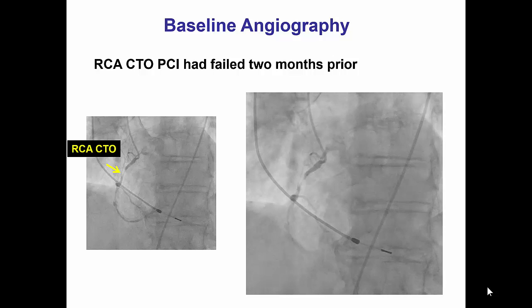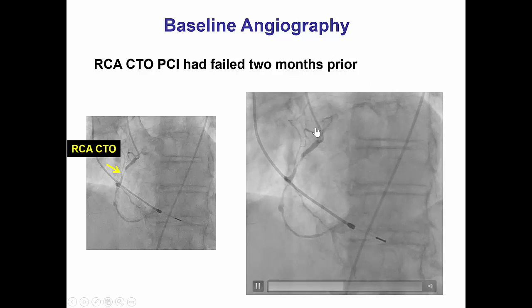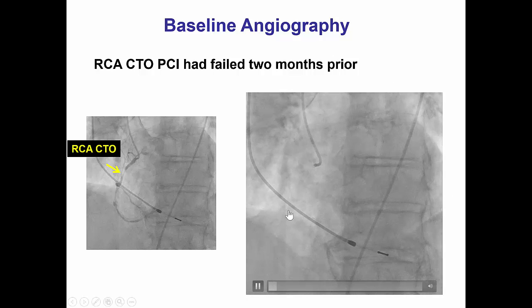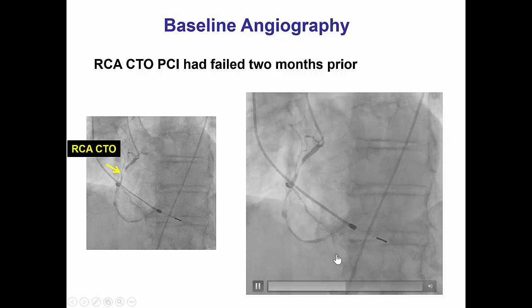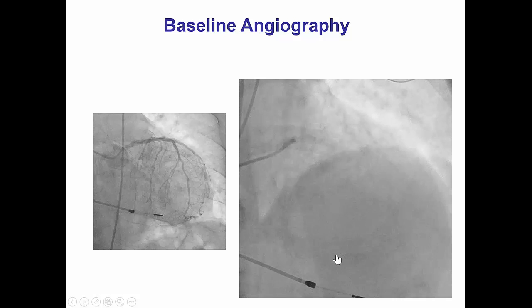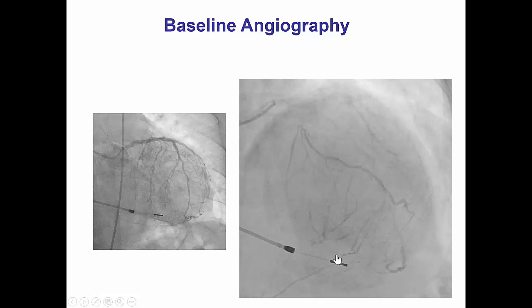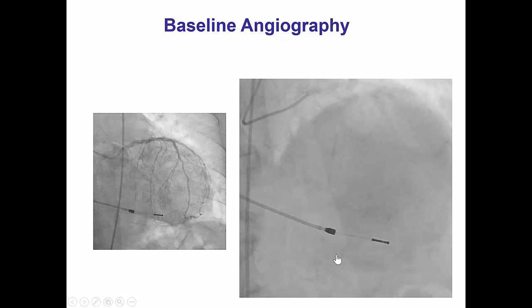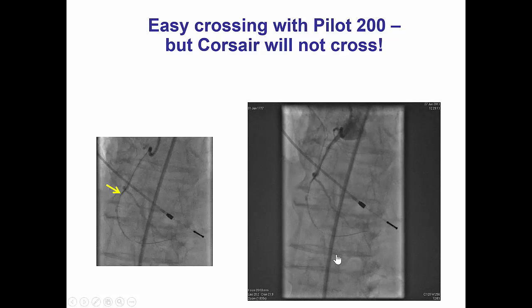Diagnostic angiography actually appeared to have a channel, so it did not appear to actually be a CTO. The vessel was heavily calcified, but there appeared to be a channel all the way from the proximal to the distal coronary artery. There was no significant disease on the left; however, there were some septal collaterals from the LAD to the posterior descending artery.